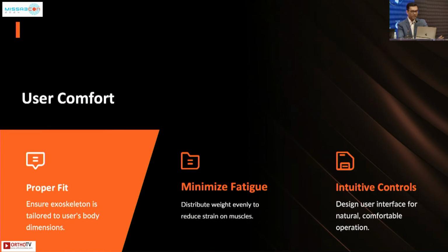So the ergonomic considerations: there's a lot of work that goes behind how this is developed, and I just want to focus on that. In development, we have to look at muscle fatigue. You can't have a device which is 300 kilograms. You can't carry it around because the patient already doesn't have muscle mass or power. So you need something very, very light. The design and the material used have to be very light, and the control and the comfort of wearing it have to be there.